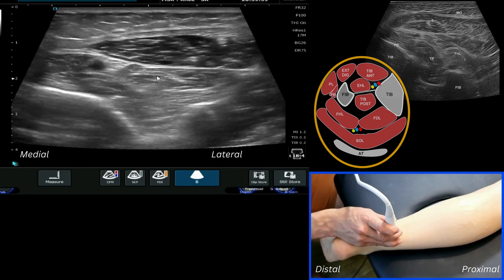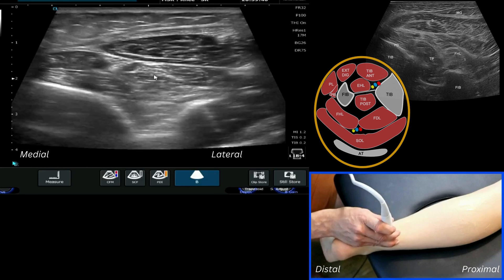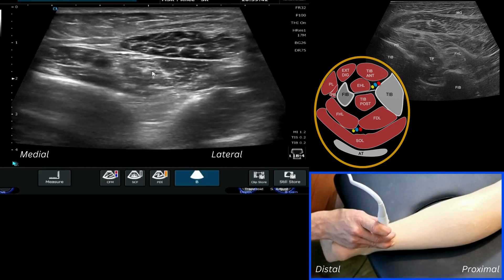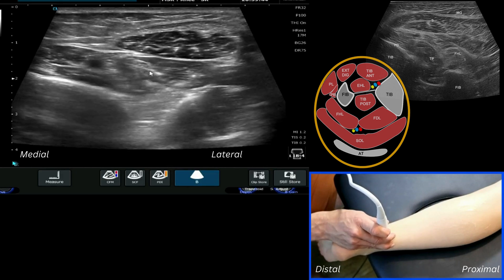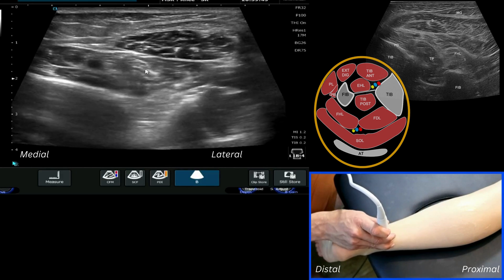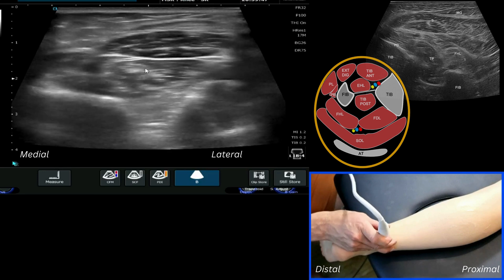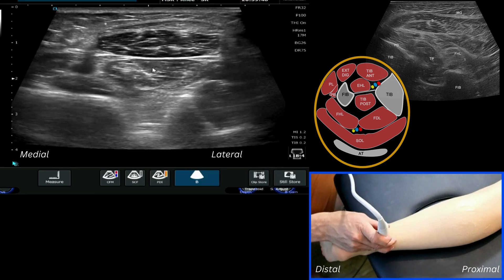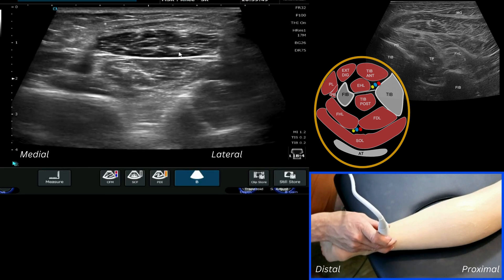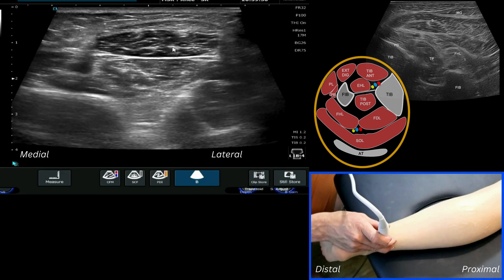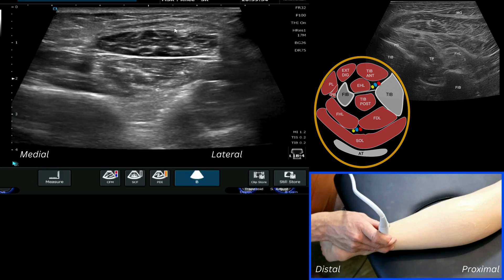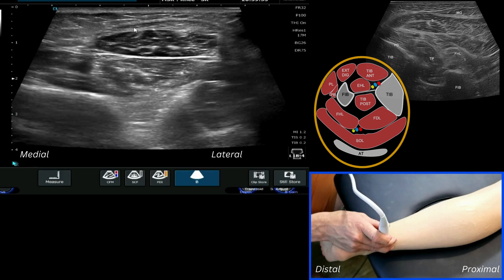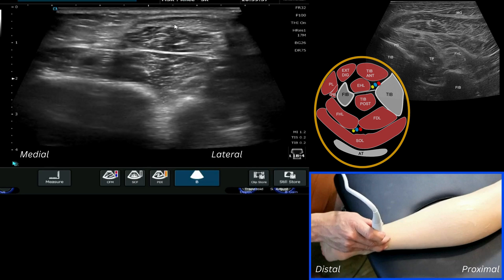As we run back down you'll start to see the formation of FHL, and if we ask the patient to wiggle their big toe at that point you can see that beautifully moving. We know then from our previous lectures that we've got the soleus and the start of the formation of the Achilles tendon at this point.